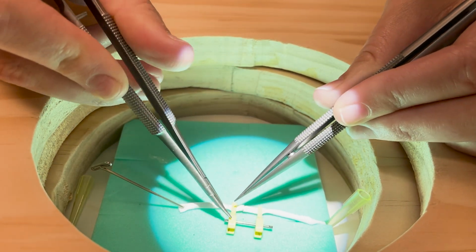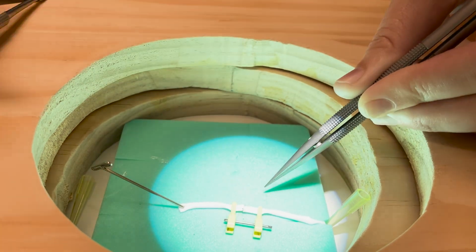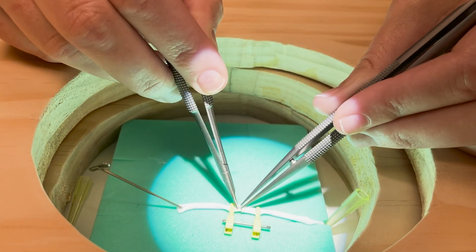3 front wall sutures are placed, and the Acland clamp is then flipped to place 3 back wall sutures. Each suture should be placed evenly along the anastomosis with appropriate spacing.